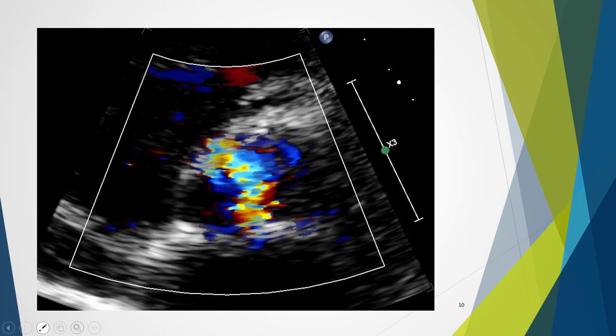Here we can see the typical cat's eye appearance when colour is applied — there is a vertical slit as blood moves through the orifice.